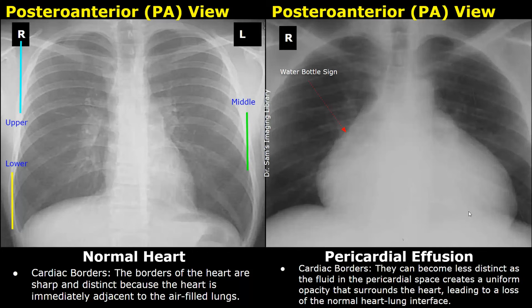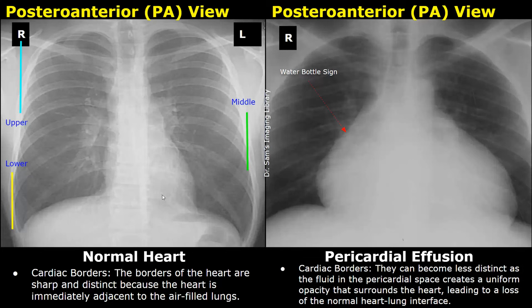Due to fluid accumulation, a uniform opacity or brightness is seen within the heart, and we do not see the normal heart-lung interface. Normally we can see the heart, lungs, and even the ribs through the heart. But in pericardial effusion there is a very bright, uniform opacity throughout — seen in moderate to severe pericardial effusion.